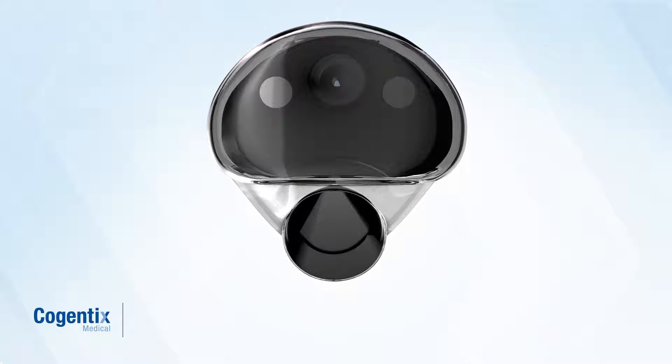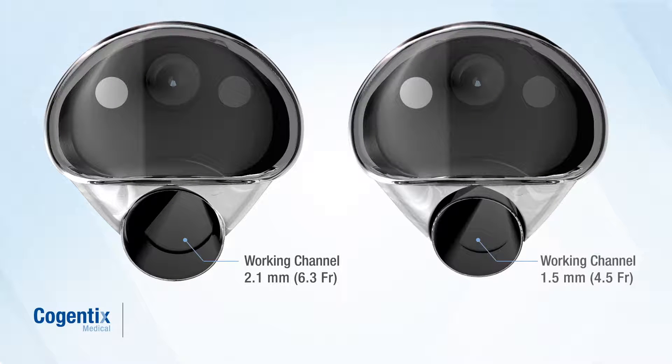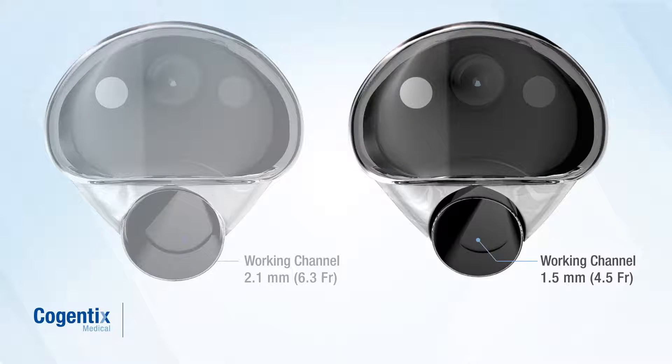The single-use Endosheath Disposables are available in two working channel diameters. For procedures that may require use of an instrument, the 2.1 mm sheath includes a disposable working channel for irrigation, suction, and instrument passage. If only irrigation and suction are needed, a narrower sheath featuring a 1.5 mm disposable working channel is available.